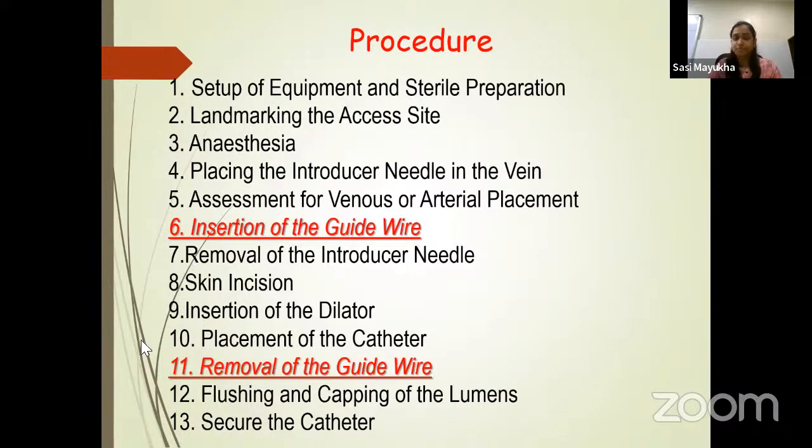the guide wire. The other important step is removal of the guide wire, because there are a lot of incidences where the guide wire has been pushed inside and the patient has been pushed to the cath lab to remove the guide wire. There are a lot of complications if the guide wire is left in place.